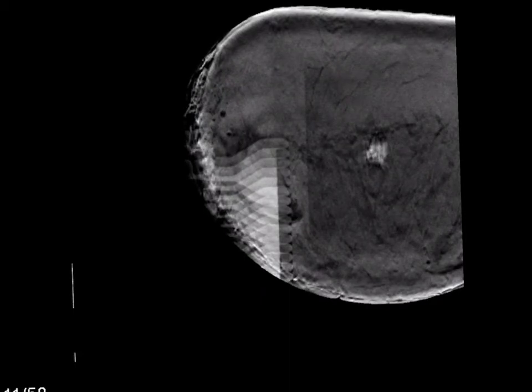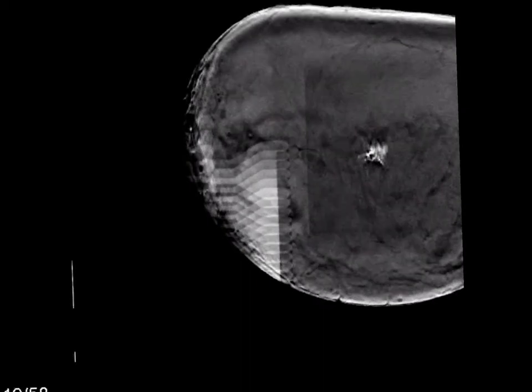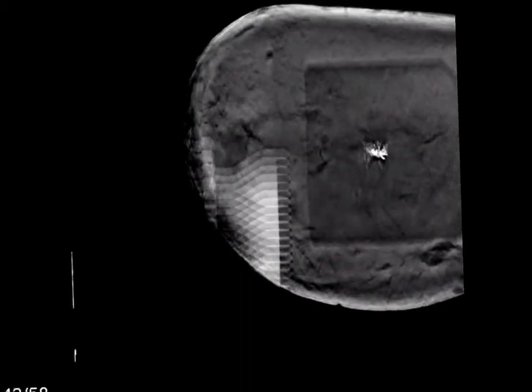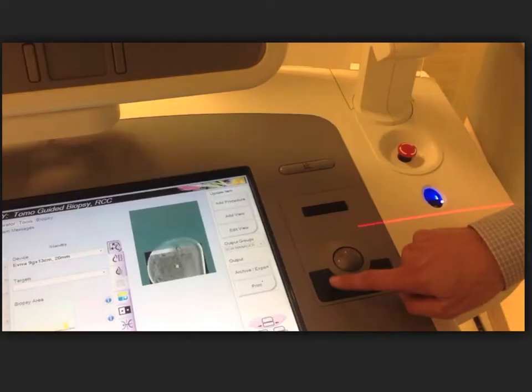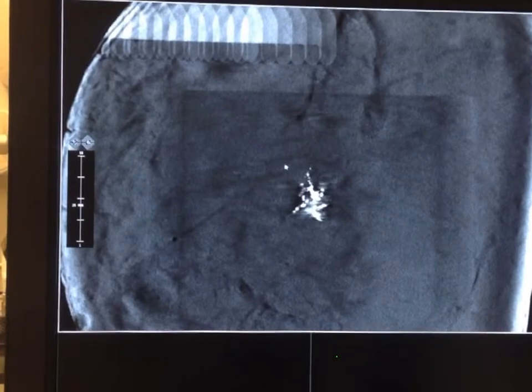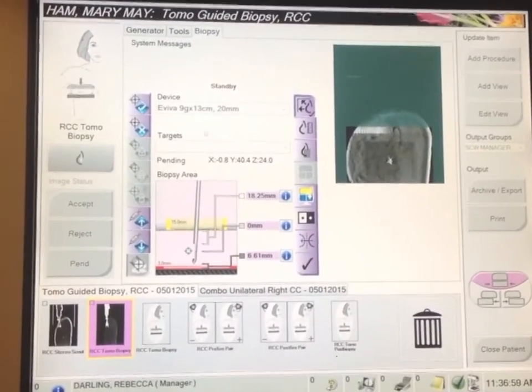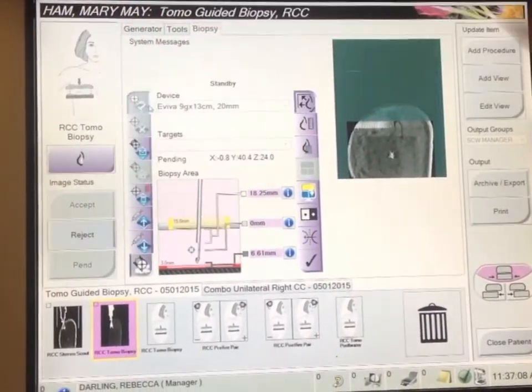Here's a scroll through of the initial set of targeting images from the scout tomo, just showing how that cluster of calcifications comes in and out of the focal plane. On the Hologic affirm unit, you use this scroll bar here to go through the tomographic images to select the slice which shows the target best and then left click to select the target once you have the cursor over the lesion. So you scroll through your tomographic images to find the best target. Once you've found it, left click the mouse in the center of the target.